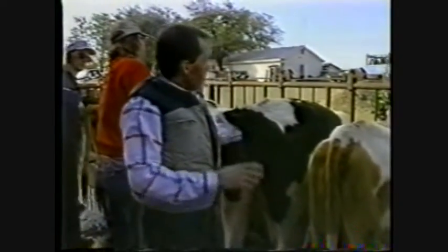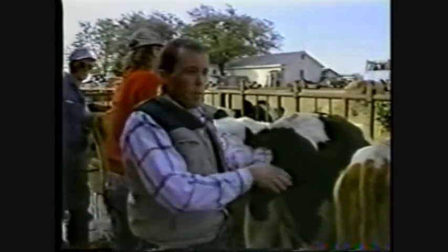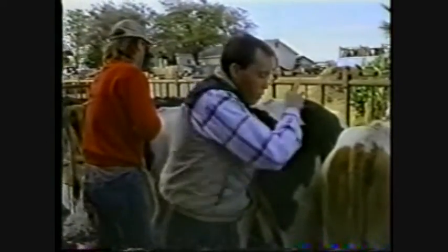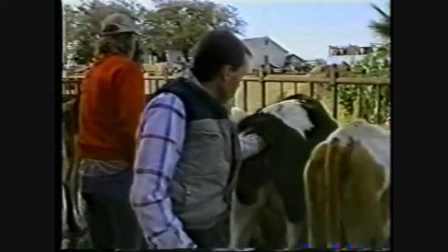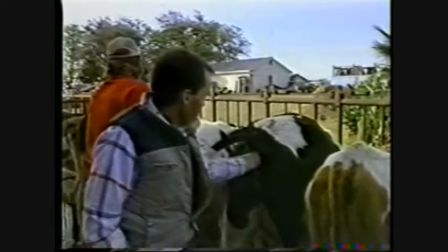Good. Sometimes if you get in here, they'll suck in a lot of air. You have a big tube of air, a tunnel of air, you can't do anything. You say, well, just try and advance and clear up in there where the rectum squeezes down close. Stick a little finger through there to hook the tissue, pull it back. She's not full of air, this one. You grab it and pull it back like that and usually get the air out nicely. So she's a good animal.